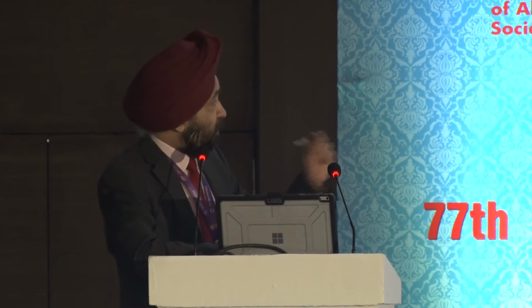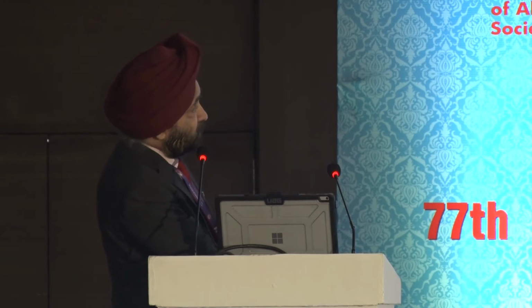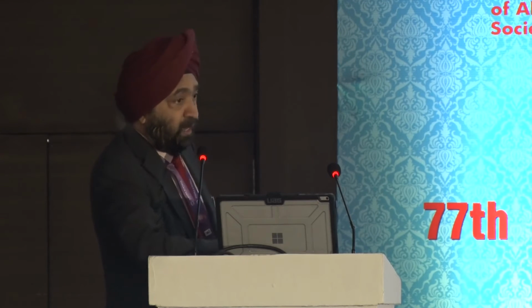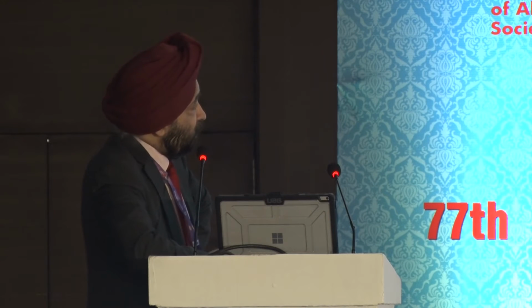You can see that the pupil is now within the Malyugin ring. When we started, we were at about 4. Now we are at about 5.5. So now we go to the femto. You can see this is a subluxation. Can you see the iris? It is a subluxated lens, which is very clear. And there was a lot of phacodonesis. It was an angle closure glaucoma with PI done. Now you can see here that once we have the Malyugin ring, we are working on the capsulotomy. We have made it centered.